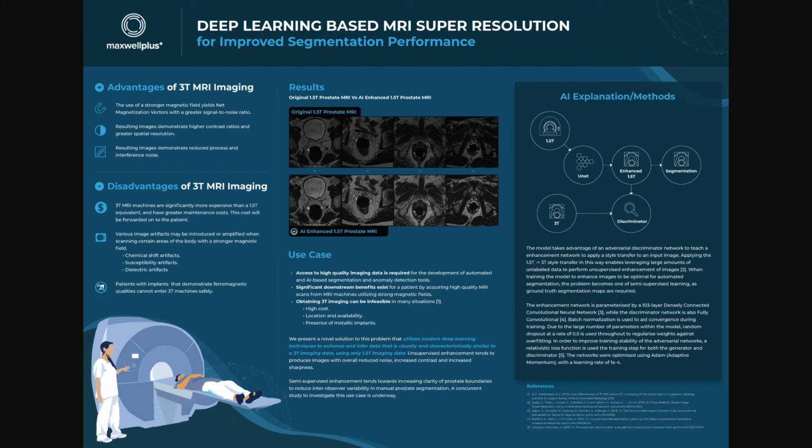There's a wonderful company in the US called Subtle Medical that is looking at speeding up MRI acquisition time by capturing less data and recreating the full scan. And in another context, it's looking at PET scans, positron emission tomography, and using less of the compounds needed for that type of imaging whilst still maintaining a very high quality image. Fantastic company, really interesting use case of this technology, and really shows how artificial intelligence in the medical field can span everything from the detection to the diagnosis, to even improving the quality and the speed of these techniques.